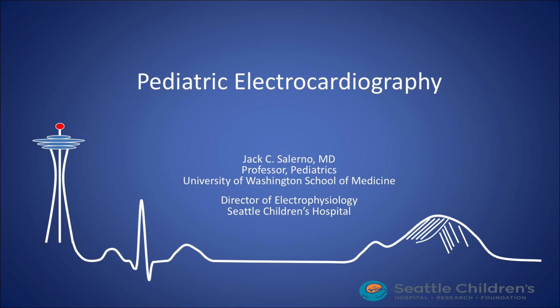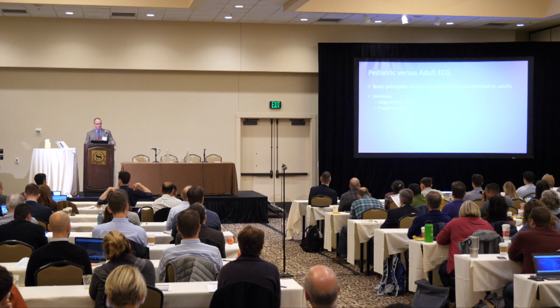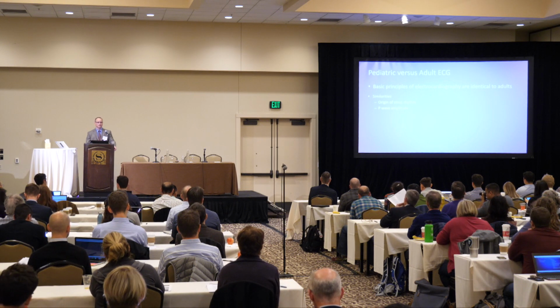So when we look at the pediatric versus the adult ECG, really the basic principles of electrocardiography are identical to adults. There are some similarities, so we're fortunate. There's the origin of sinus rhythm and P wave amplitude. And actually the P wave amplitude I thought was pretty cool. It's something that I learned. It's the same all the way through, from birth to death. So we have that going for us.